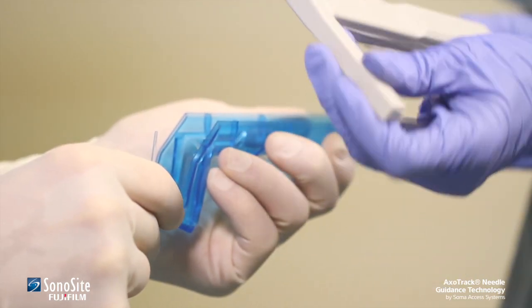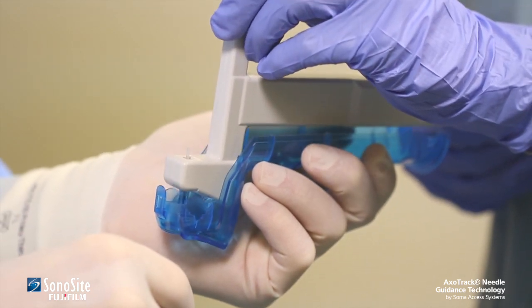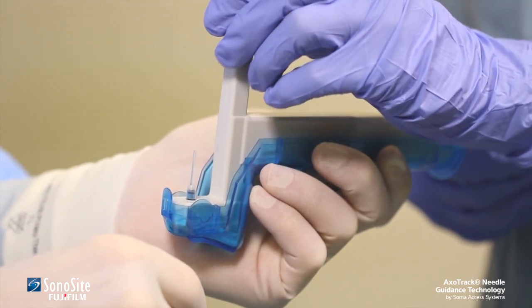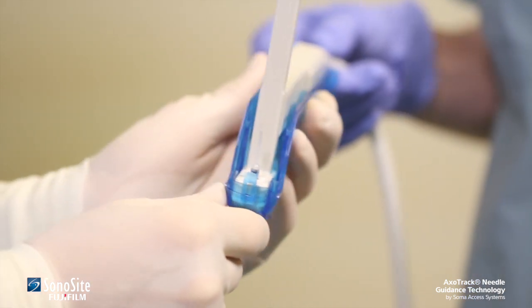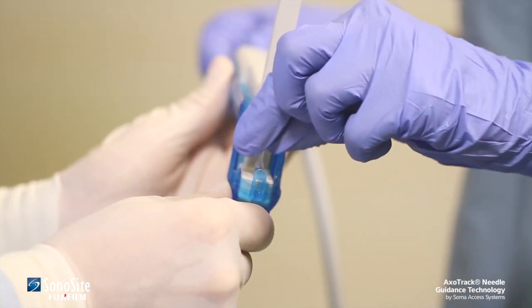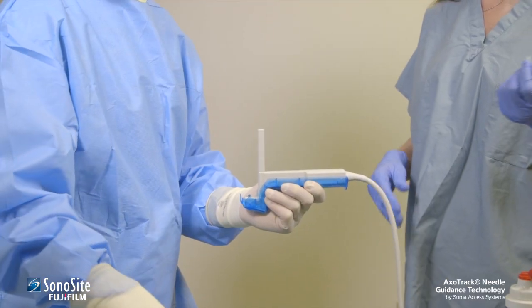The assistant lowers the transducer into the bottom half of the transducer shield until it is fully seated. Care must be used to avoid contaminating the practitioner's sterile gloves. The protective cap is removed by the non-sterile assistant, using care to avoid touching the sterile bottom shield.